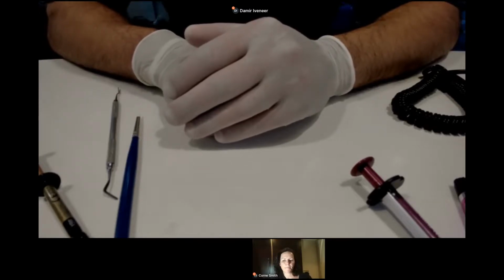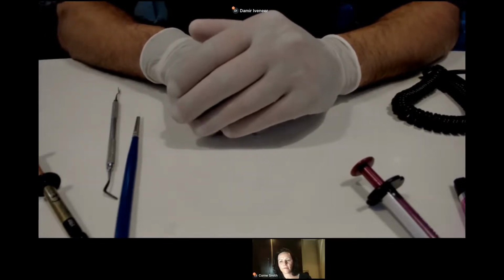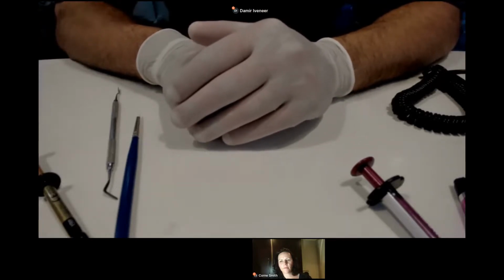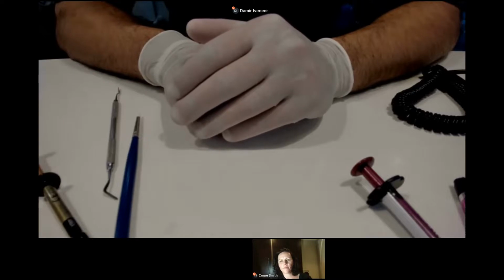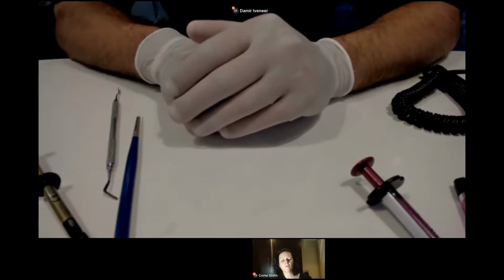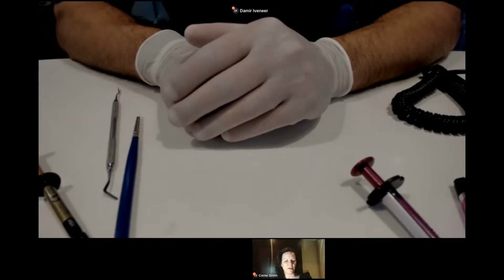First of all, I'm cleaning the teeth. If there is some caries, I remove the caries. I work with silicone brushes, and then I work with aluminium oxide, and then I do the etching process. This is my protocol. Yeah, I think as long as you just clean the enamel, then you're completely fine. You don't have to do any reduction on the enamel. Aluminium oxide is probably the best thing to use there.